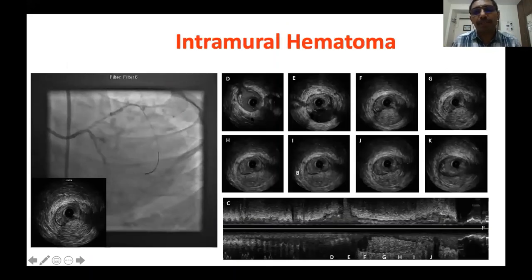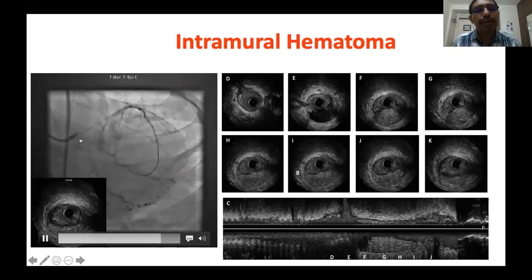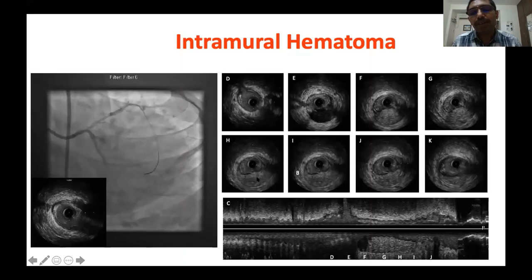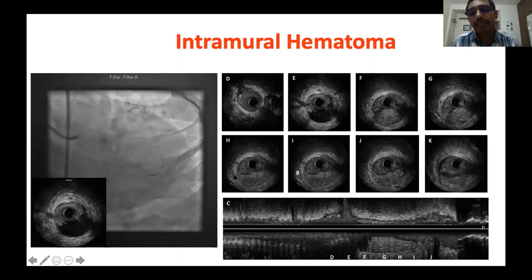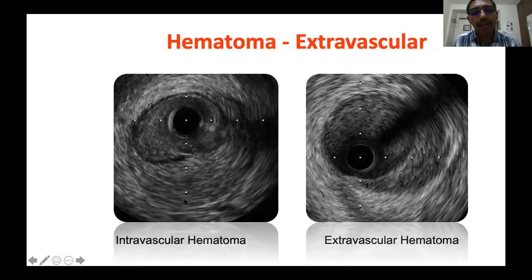Intramural hematoma is the accumulation of blood in the medial space, commonly resulting from balloon dilatation or stenting. It is a continuation of dissection — when one side is closed, blood cannot move distally and accumulates inside, causing hematoma. The typical appearance: here is the medial space and here is the lumen. Following the media, it is split into two — part of media and part of media — with accumulation of bright RBCs densely packed inside your medial space. That is the typical appearance of intramural hematoma.